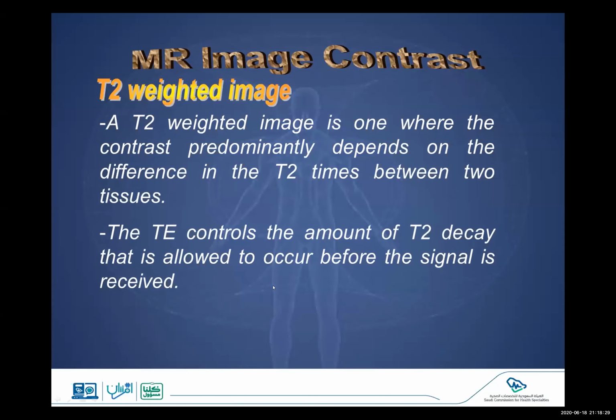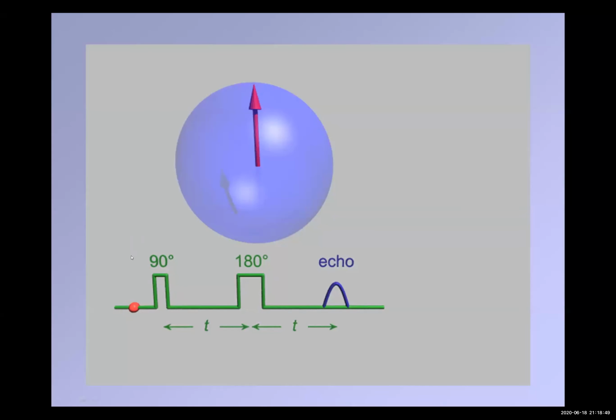The key important parameter that measures this is the echo time. The more echo time you give to the protons, the more dephasing. So you can see which one is dephasing fast and which one is dephasing slow. So TE is a key factor. And this is an example.